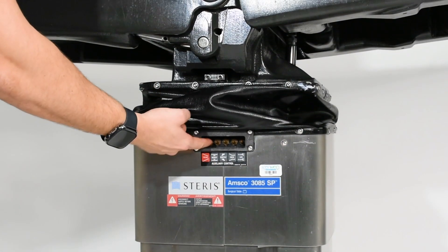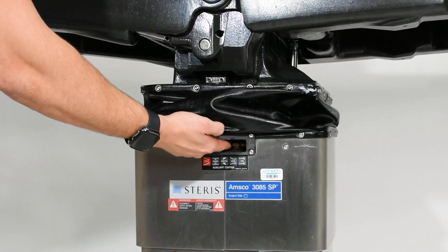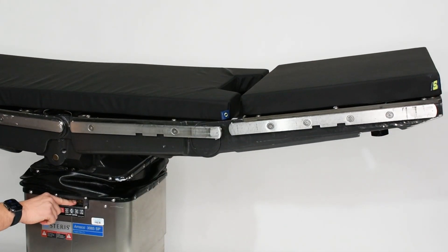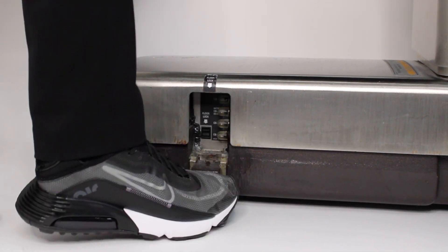In case of hand control failure or power loss, the AMSCO 3085 SP comes with auxiliary override controls, a manual table lock, and manual foot pump.